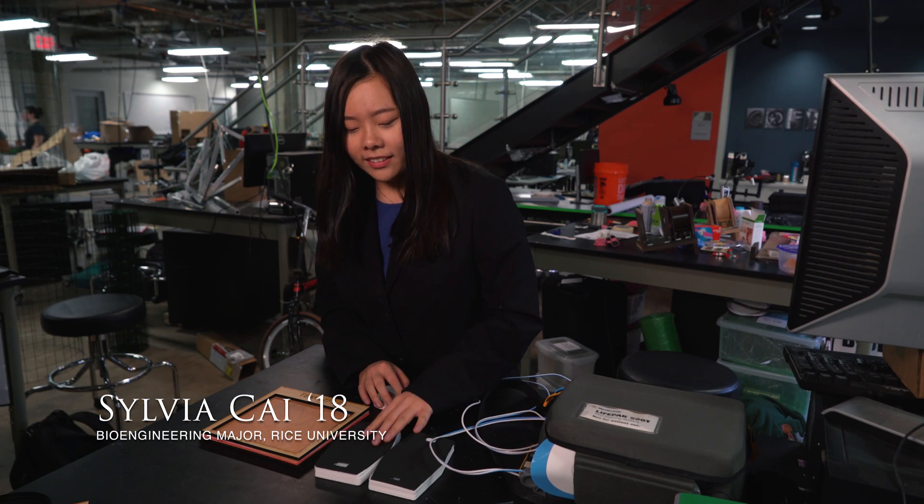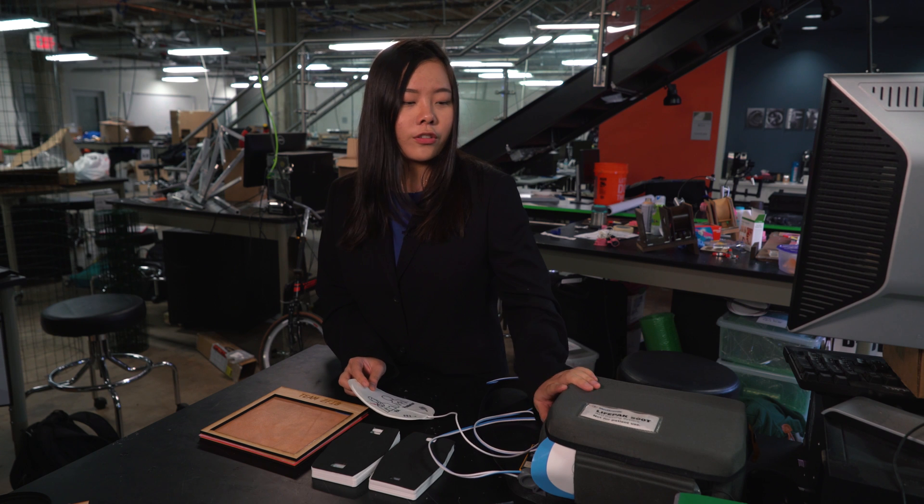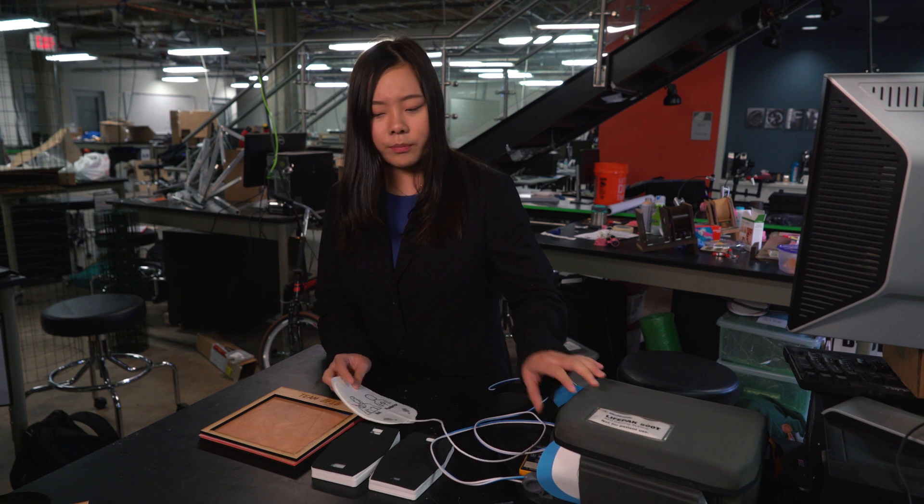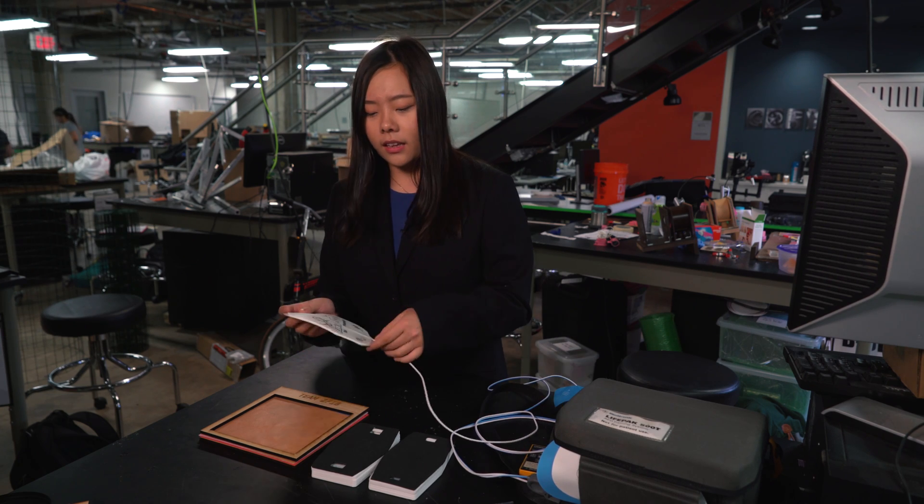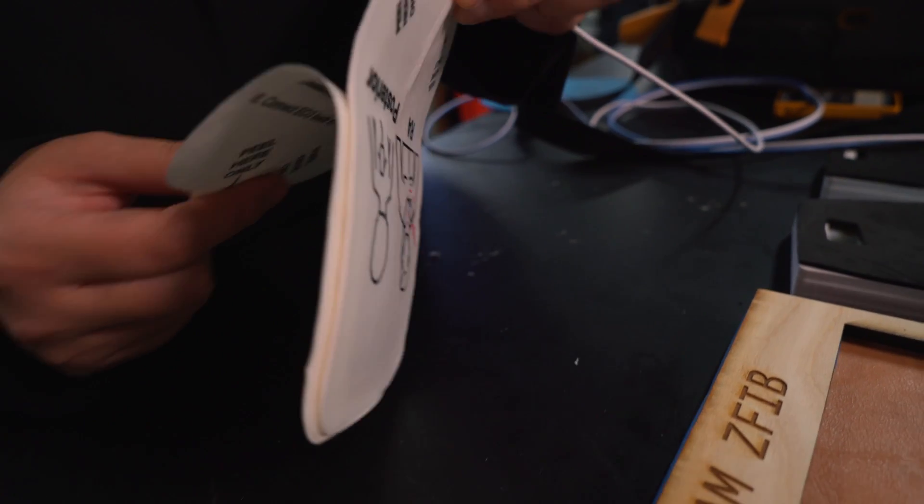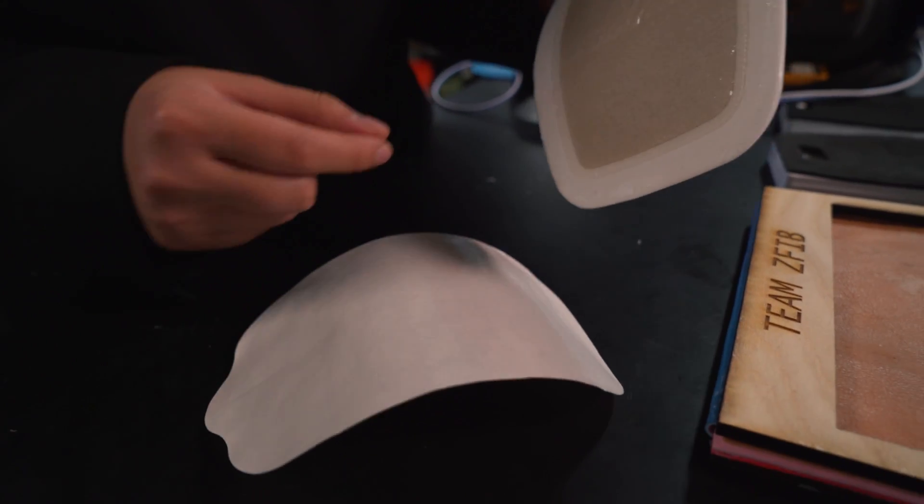This is our device that we created to add on to the normal AED pads. When someone is suffering from sudden cardiac arrest, you usually use this AED to save people. We first attach it to the AED, peel off the AED pad, and attach it to the person.